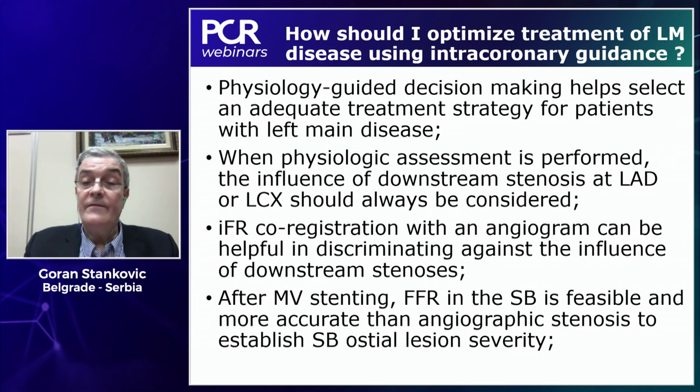Then, when physiological assessment is performed, the influence of a downstream stenosis in LAD or circ should always be considered. IFR co-registration with angiogram can be helpful to discriminate the influence of downstream stenosis. And after main vessel stenting, FFR in the side branch is feasible and more accurate than angiographic assessment of side branch severity.